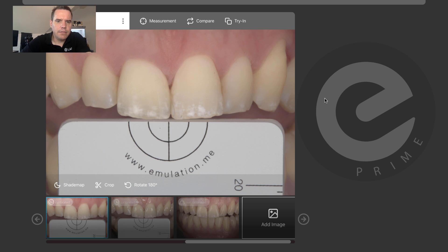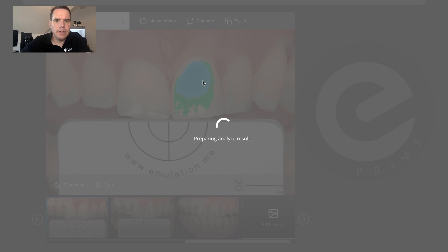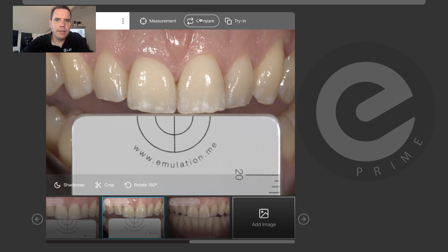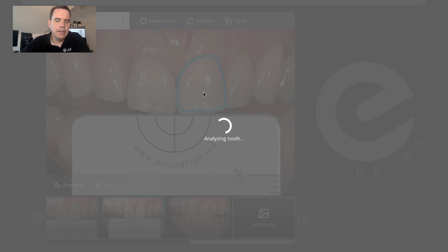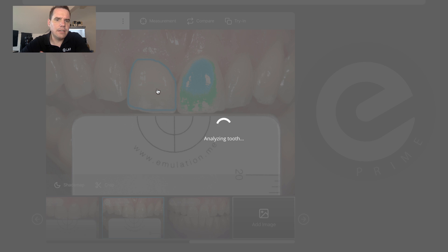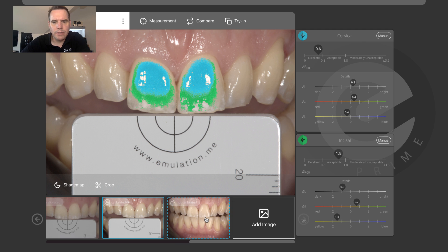This is the final result photographed in the mouth with the gray reference card. The immediate visual impression is very good. We can compare numerically using quantification in the compare mode using the cross-polarized image first — and as you can see, that's a delta E of 0.9, which is a really excellent result. This one here is the reflected image, and you can measure the color here as well because of the artificial intelligence algorithm, which can detect surface reflections and other things that don't belong to the tooth color, so it can sort of measure around that. Here the delta E value is even a little bit better — in any case, a very fine result was achieved.